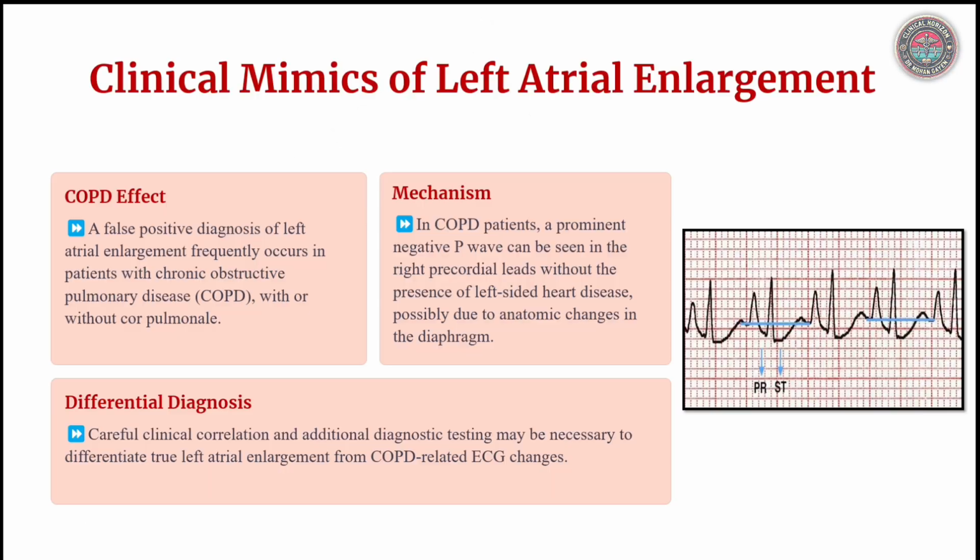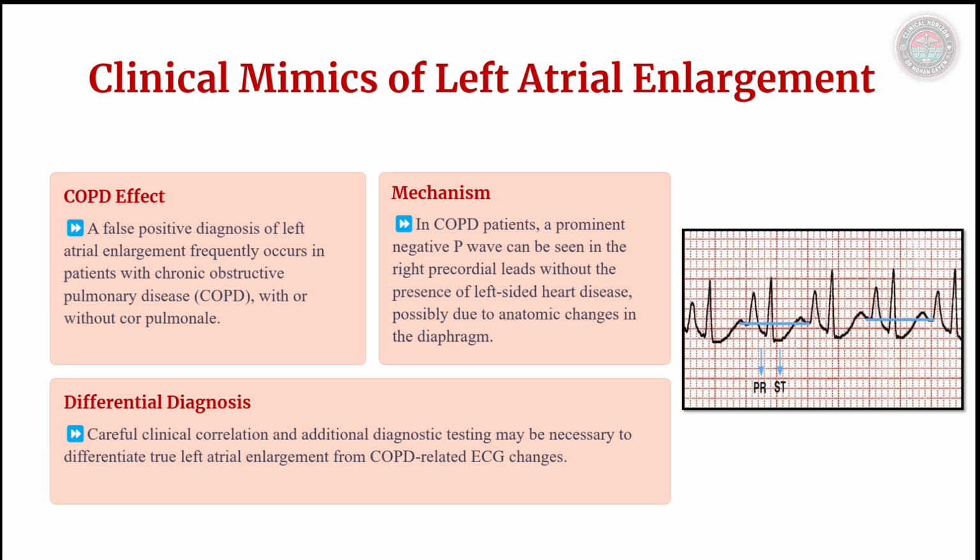Clinical mimics of left atrial enlargement. Conditions like COPD can produce ECG patterns mimicking left atrial enlargement due to diaphragmatic displacement and altered atrial conduction. Differentiating true left atrial enlargement from positional changes requires clinical correlation and imaging studies.